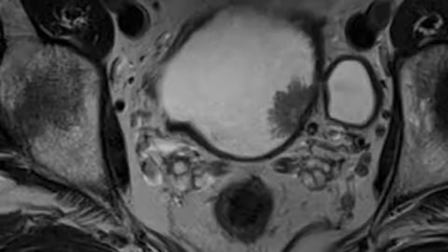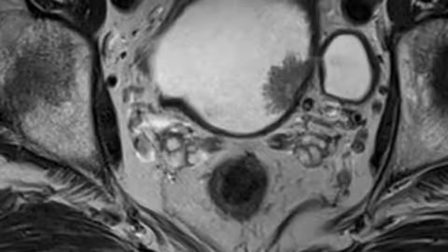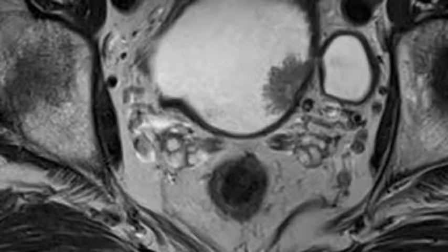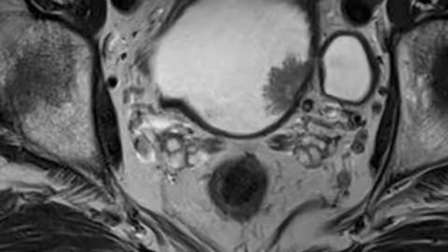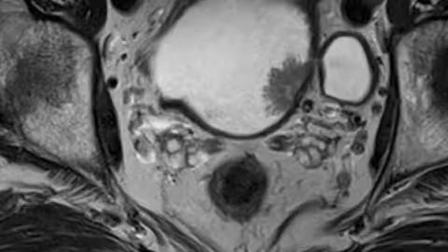Recent advances in MR imaging technology have made 3D imaging feasible. Relative to two-dimensional sequences, 3D sequences offer the advantage of shorter acquisition time, volumetric coverage without intersection gaps, and an improved signal-to-noise ratio. Techniques that are useful in rapid pelvic imaging include non-breath hold ultrafast spin echo T2 weighted images and steady-state free precession imaging sequences.